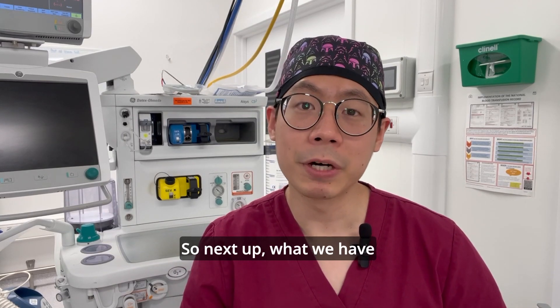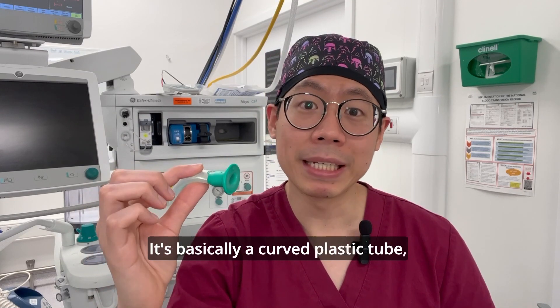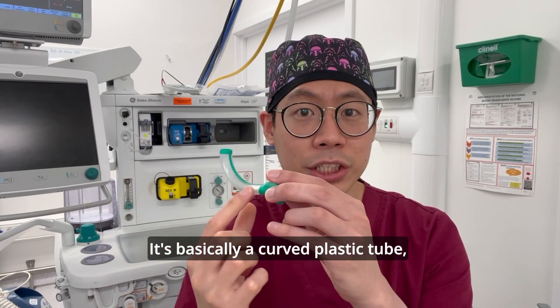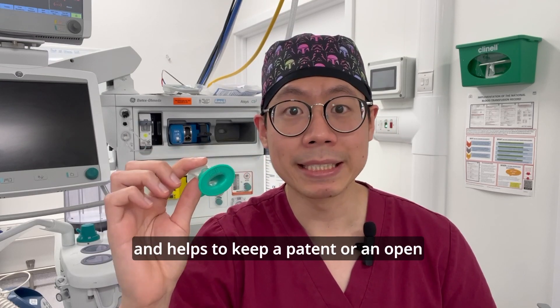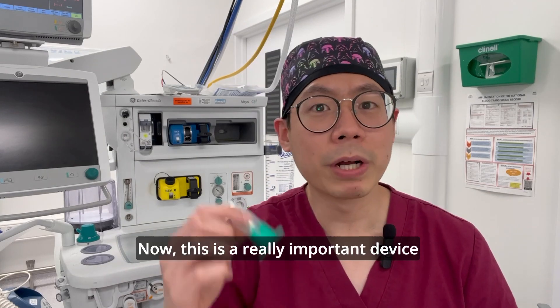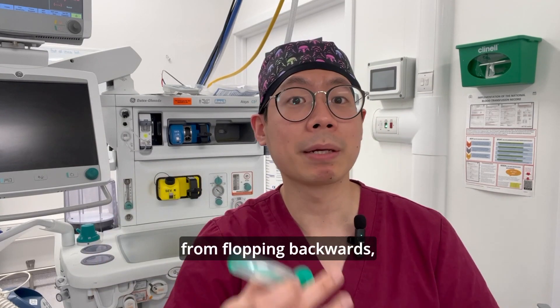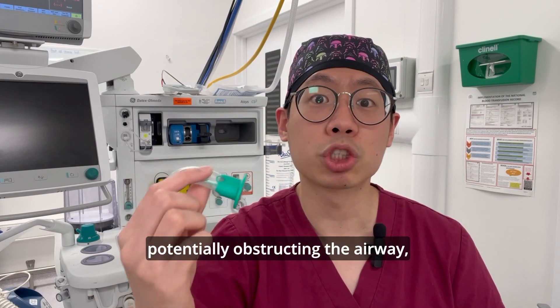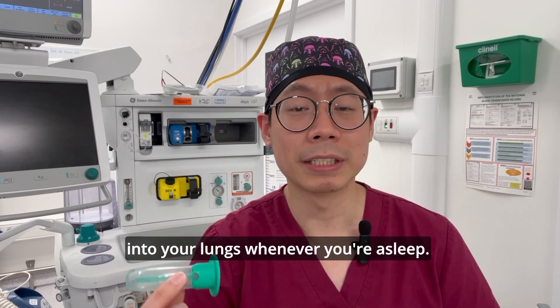Next up, what we have here is called a Guedel airway, also known as an oropharyngeal airway. It's basically a curved plastic tube which is inserted into the mouth and helps to keep a patent, or open, airway in unconscious patients. This is a really important device because what it does is it prevents the tongue from flopping backwards, potentially obstructing the airway, and allows us to improve oxygen delivery into your lungs whenever you're asleep.